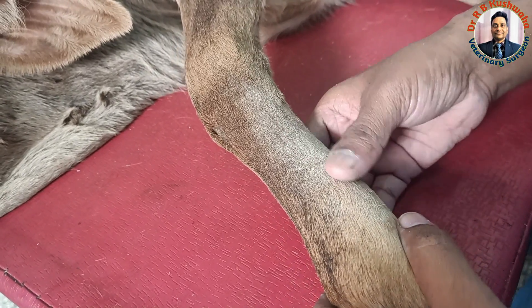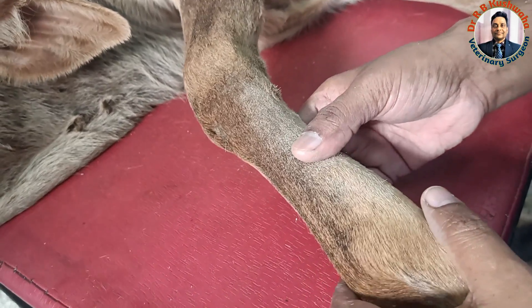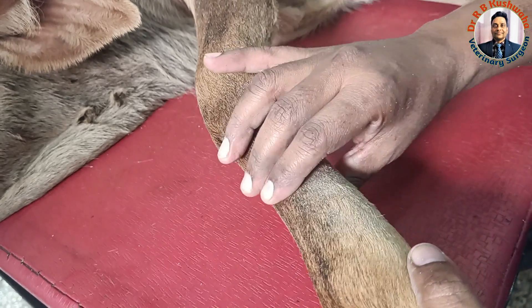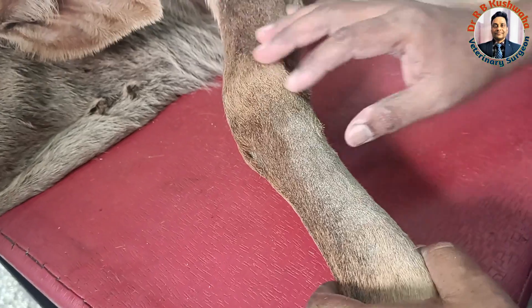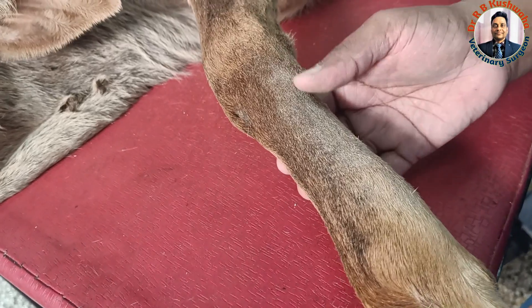We incorporate the splint because the plaster of Paris cast alone is not enough to sustain the weight or to immobilize the fracture appropriately, since the drying period of the POP cast is too long. That is why we always incorporate the splint first, then apply the plaster of Paris bandage.